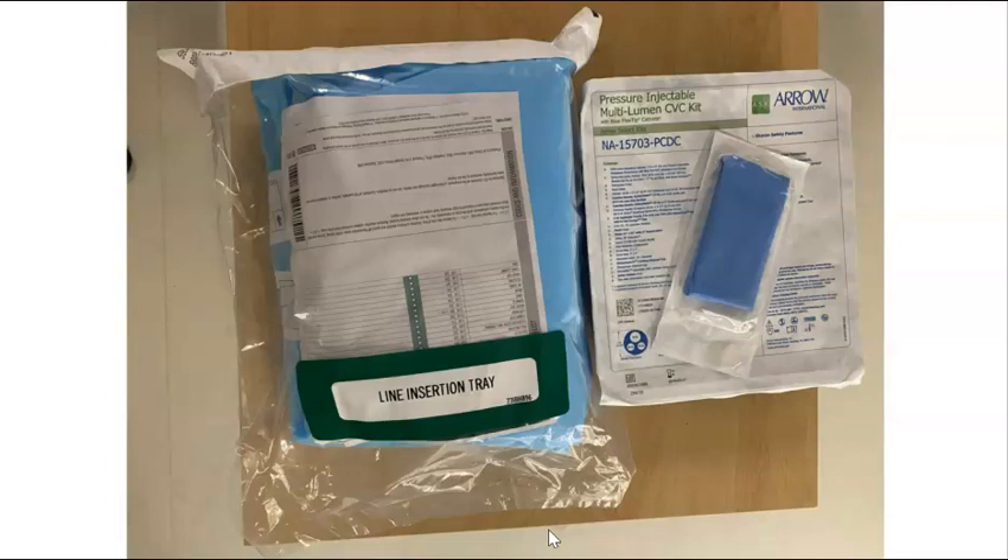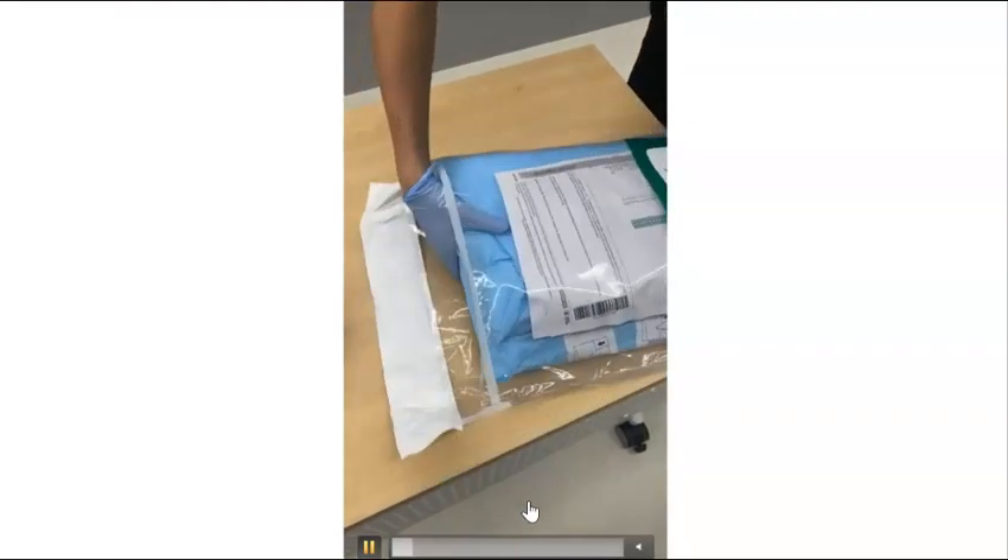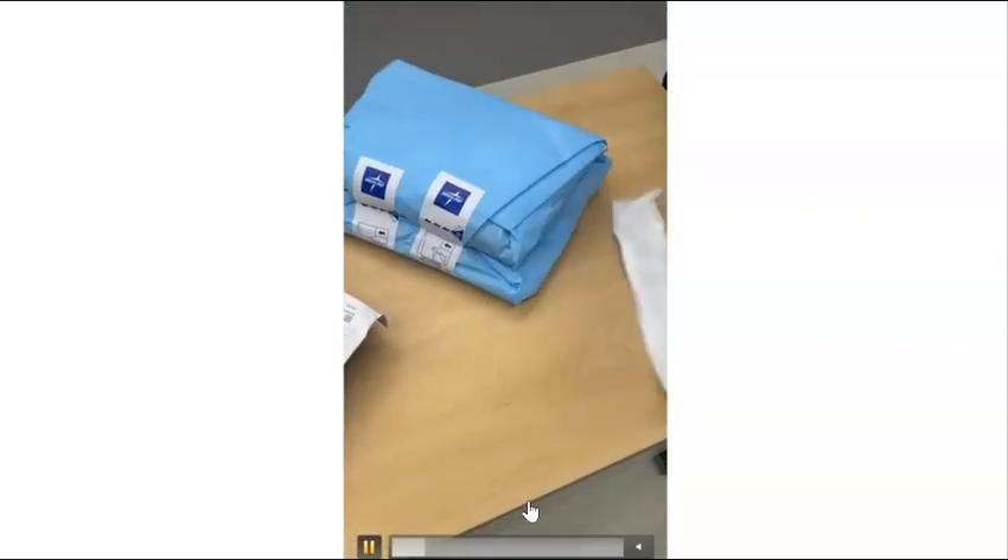Not pictured is your ultrasound machine and your sterile gloves, gown, and hairnet. Remember, this is a completely sterile procedure. Once your equipment is gathered, you will open everything up, remembering to maintain a sterile field.